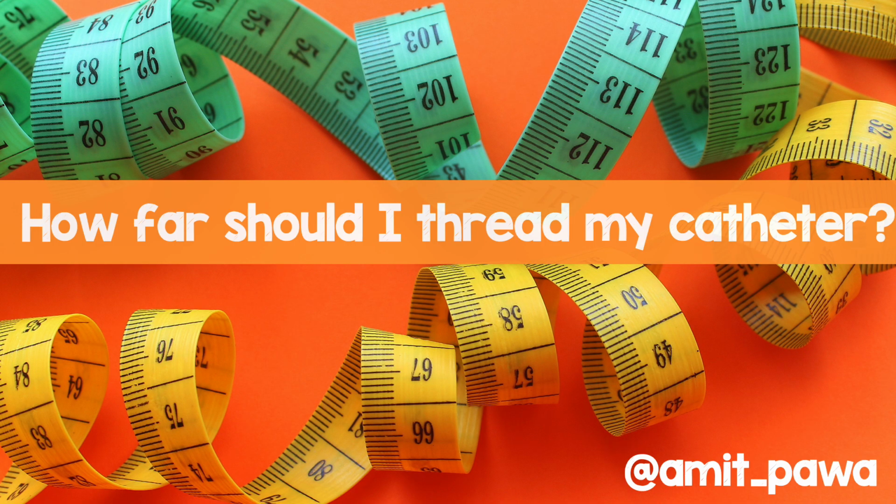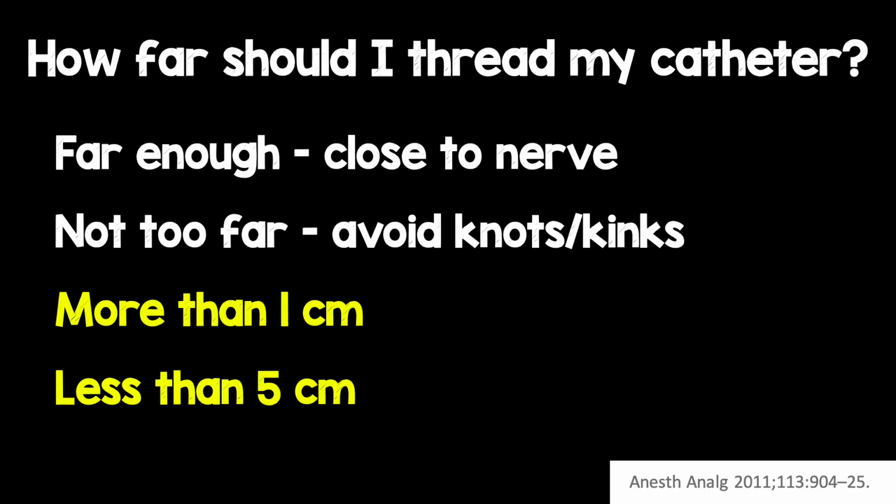Okay, so once we've done all of that, how far should we be threading our catheter past the needle tip? Well, the answer is it needs to be far enough so you're close to the nerve, but not too far so you don't get knots or kinks. So probably the answer is more than 1 centimeter, but less than 5 centimeters.